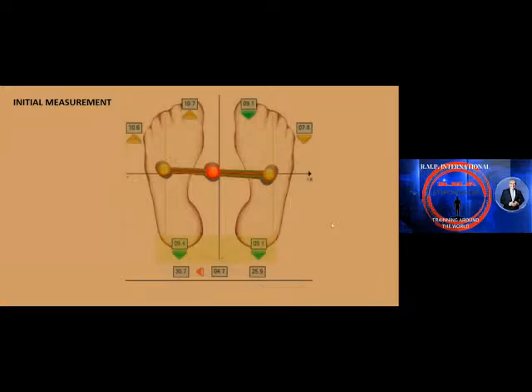We have here the calcaneus losing weight, green, a triangle pointed back. That moves the body forward. Overloading this area in the foot. Imagine the suffering of this area due to the occlusion. Overload, first and fifth metatarsus.